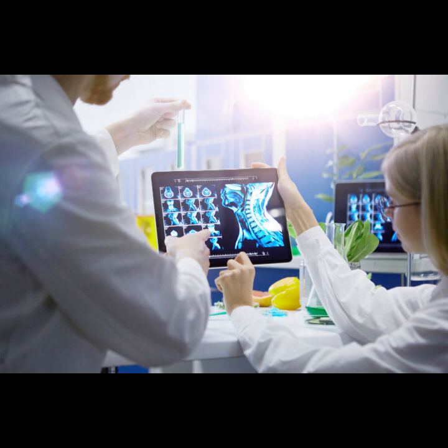It's a balancing act. Okay, so we're constantly fighting physical limits. Gradient strength, how hard can we push? Slew rate, how fast can we turn? And signal decay, how long does the signal last? This brings us to the really cutting-edge stuff. Using AI, specifically deep learning, to optimize the k-space trajectory itself.